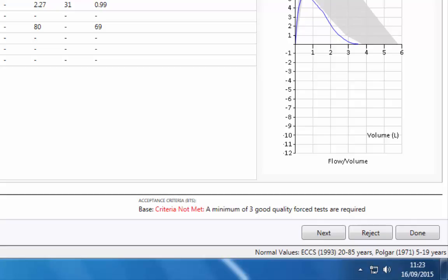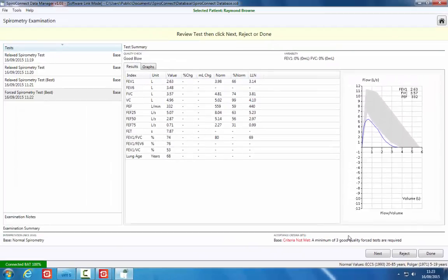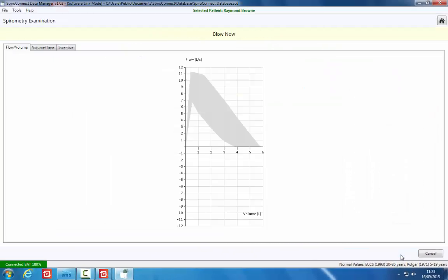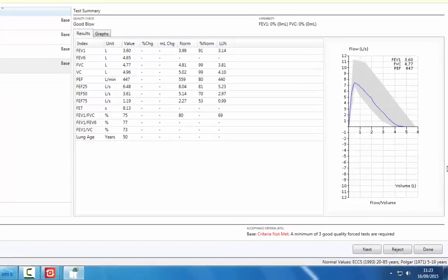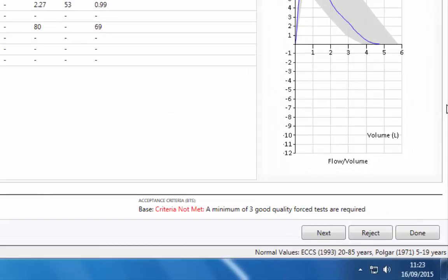If the forced blow was of unacceptable quality, click the Reject button. This will only discard the most recent blow; previous blows will be retained. To accept the blow and perform a second, click the Next button.